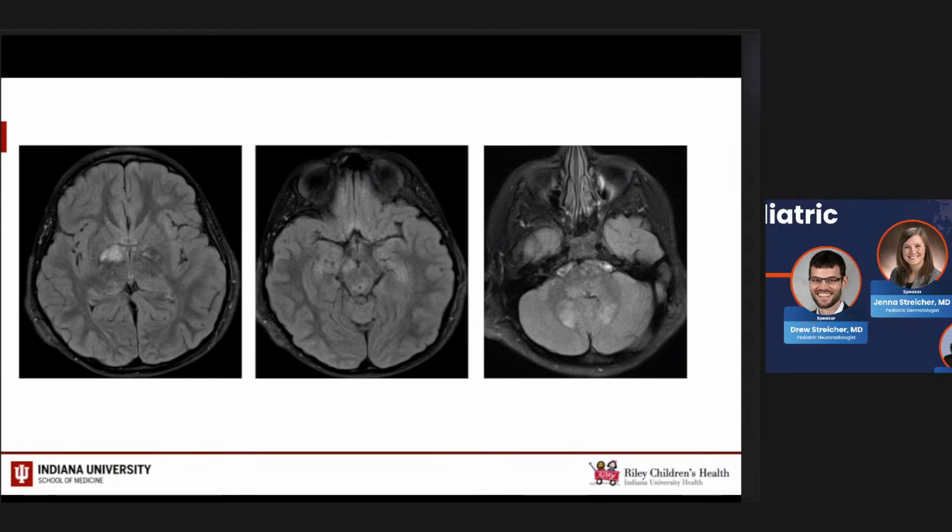So what makes us then question a low-grade glioma? Well, if it's more defined, if it enhances, if it's fairly large, those would certainly raise suspicion, and those patients we would probably follow a little bit closer. Otherwise, these areas of signal abnormality, we typically just call dysplasias.